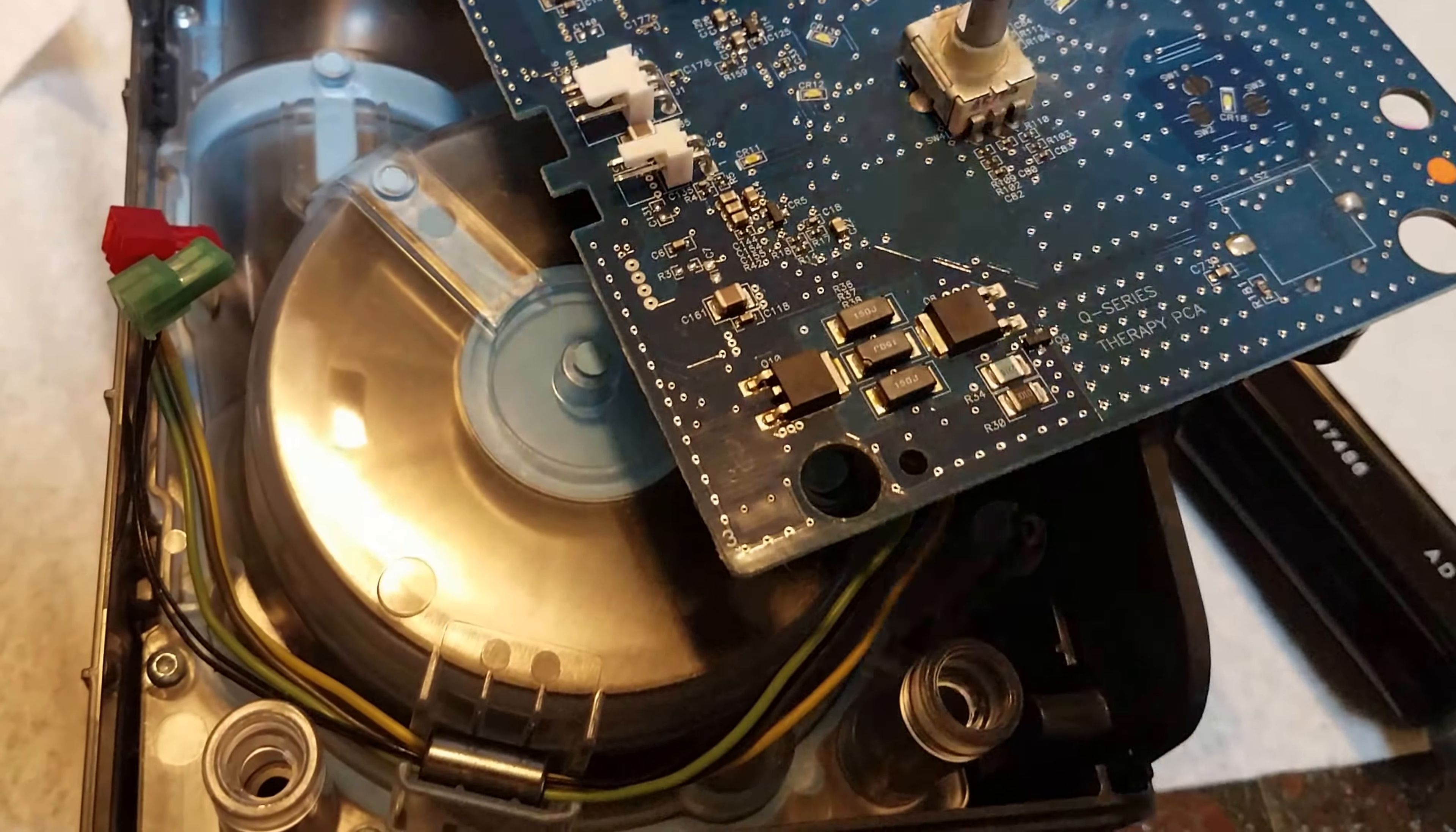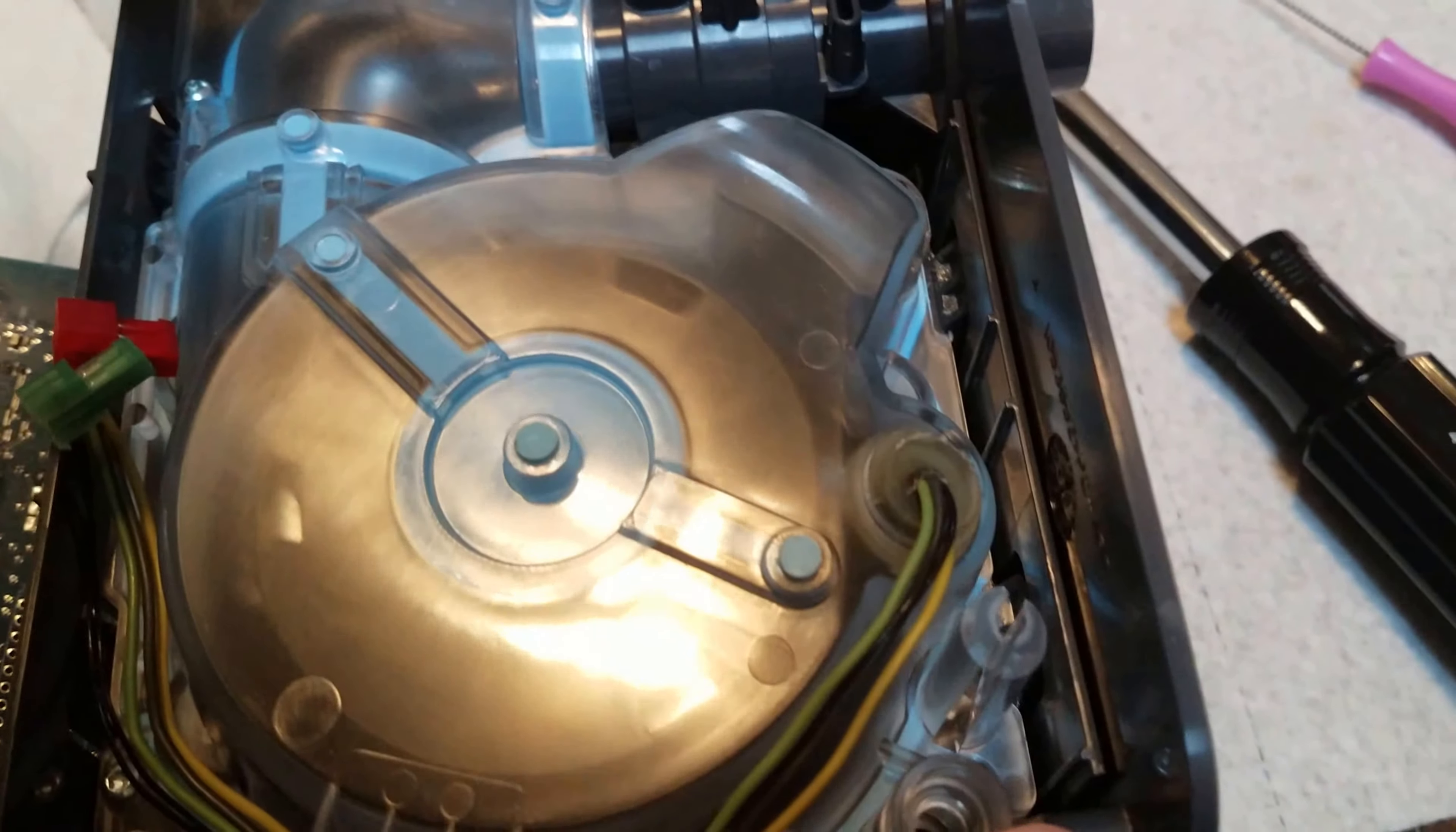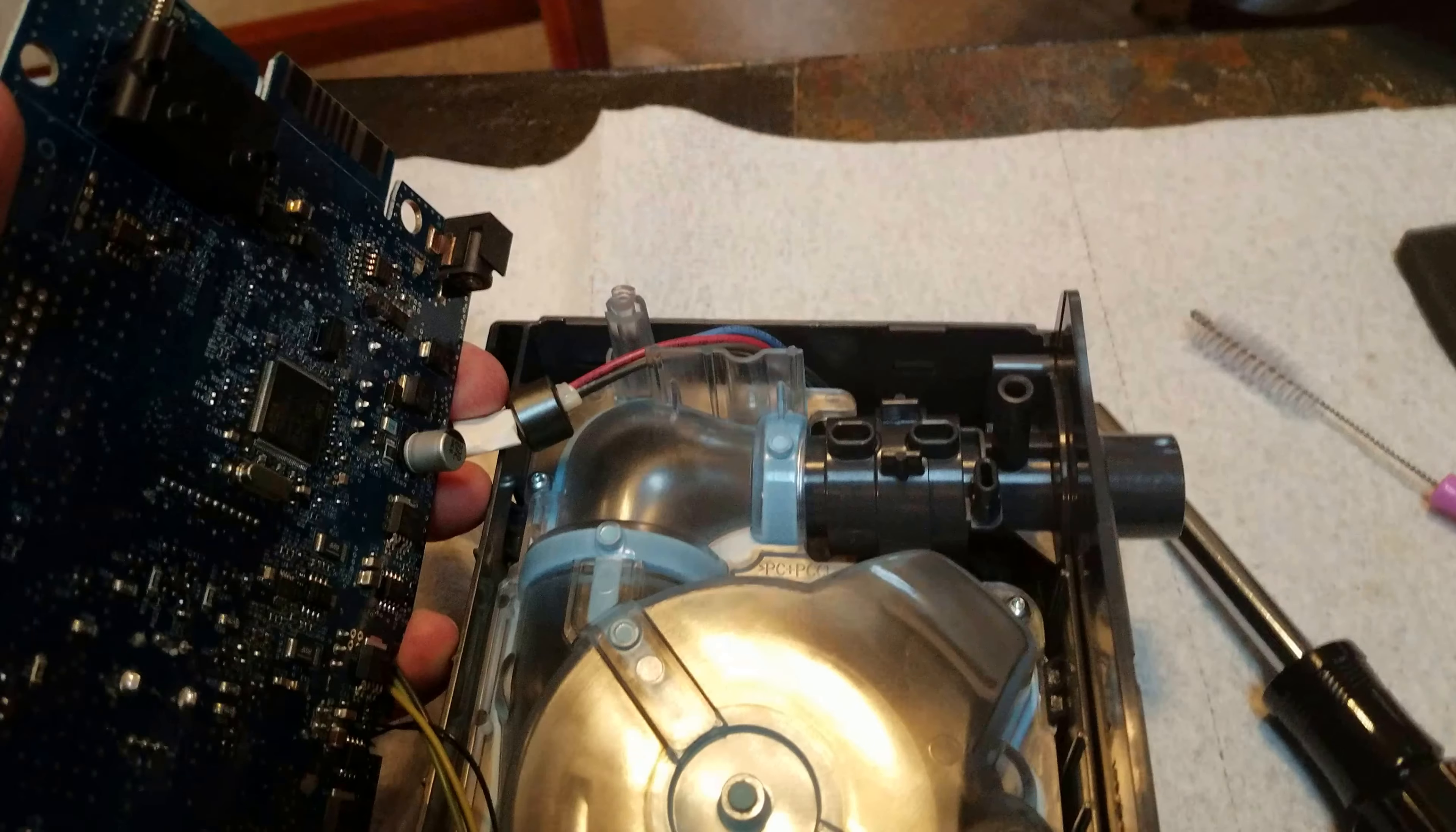Let me get this all tucked in and then you'll see it in a moment. There's also clips here that when you push it on, these little plastic clips spread and hold it into place. There's I believe two of them, one here and one here. Those will hold the board into place.